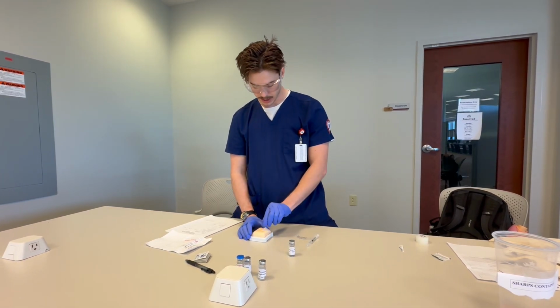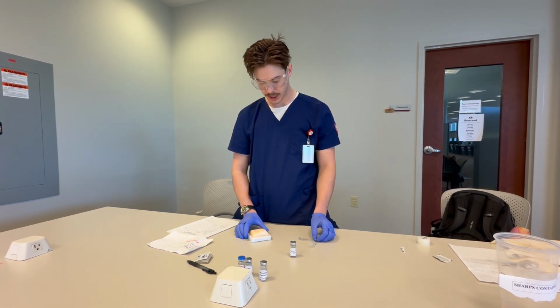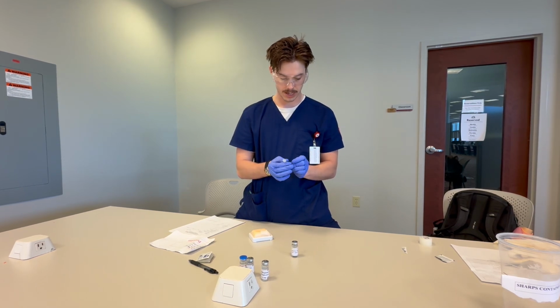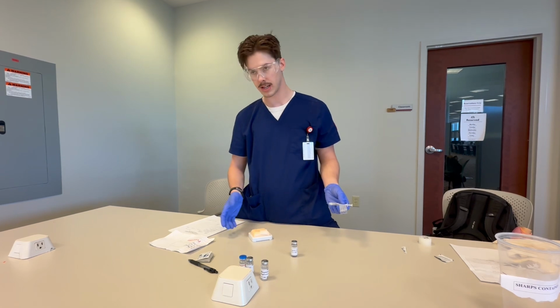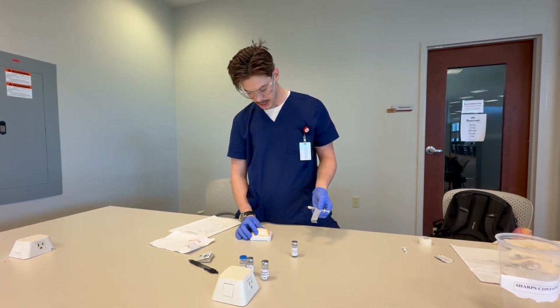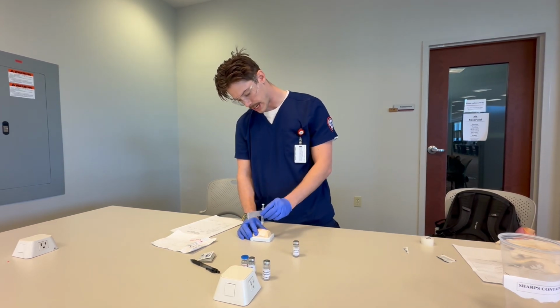If you can pinch 2 inches of skin, you will give it at a 90-degree angle. 1 inch of skin, you will give it at a 45-degree angle. On Mr. Jones here, I am able to pinch about 2 inches of skin, so I'll give it at a 90-degree angle here.